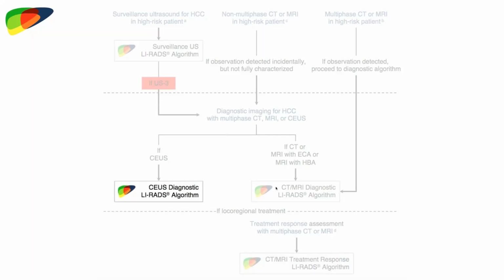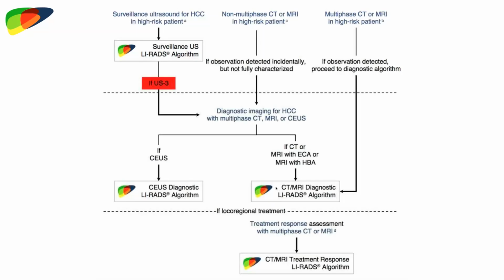Contrast-enhanced ultrasound LI-RADS is what we'll be talking about today, and then Dr. Ayat Kamaya on Wednesday gave us a great talk on ultrasound LI-RADS for screening and surveillance. So this kind of shows how these 4 systems work together. And I would like to discuss today how I see contrast-enhanced ultrasound LI-RADS being used in the broader workflow of workup of patients at risk for HCC.